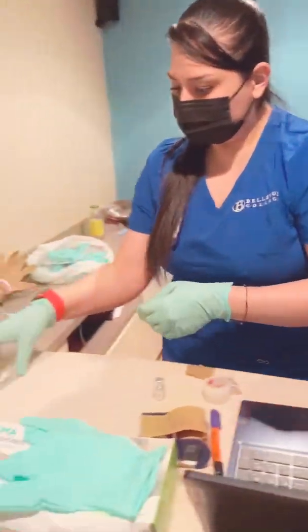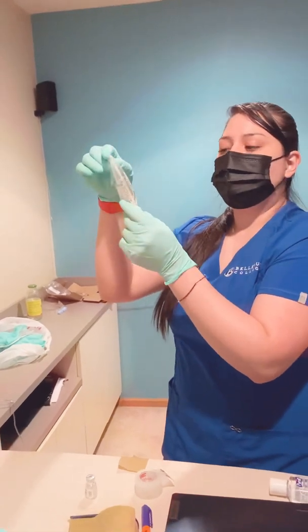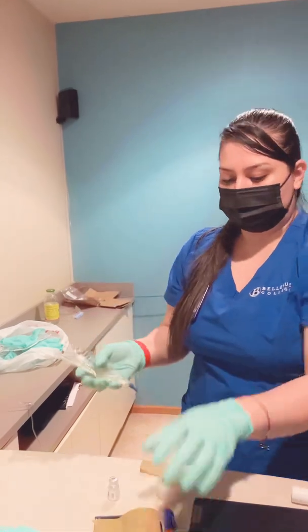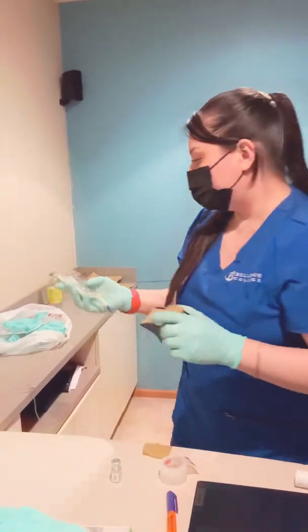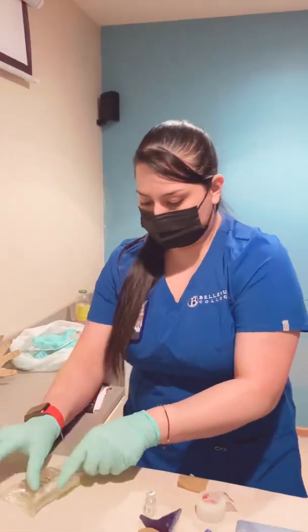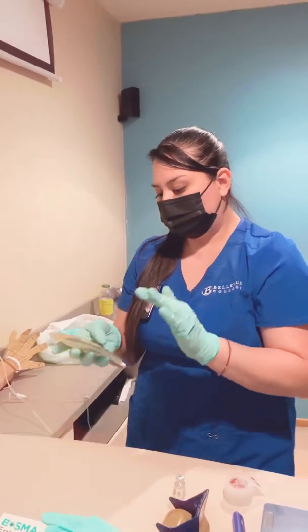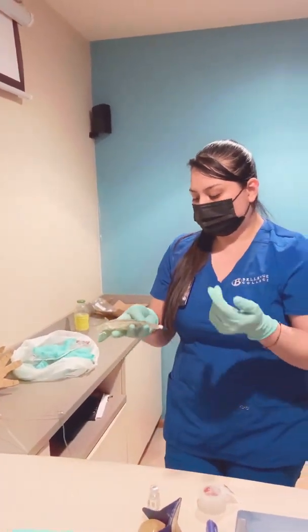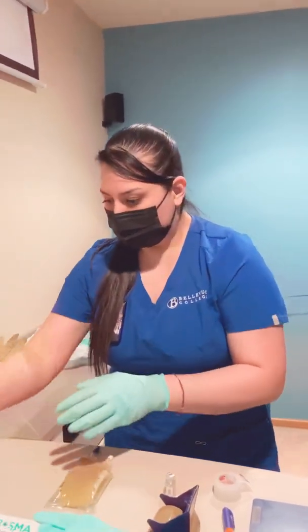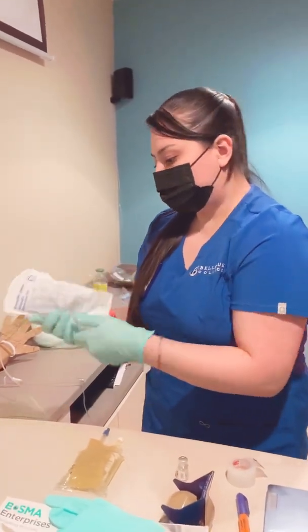And I am going to take my medication, check the color, the clarity, and the expiration date, and no damages to the bag. I'm going to scan the medication. I'm going to scan the patient's wristband. And I'm going to then label it with the medication name, the dose, the time, and my initials, and it's for urinary tract. I'm going to open my secondary medication set.